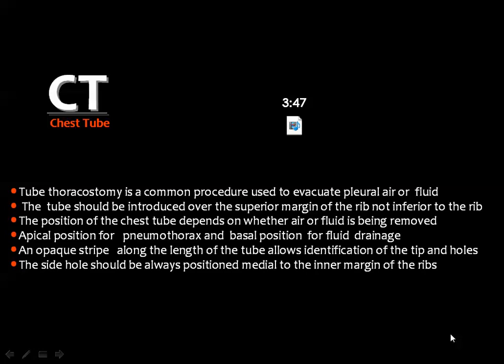Then we came to the chest tube or the thoracostomy tube, which is a common procedure in the ICU patients used to evacuate pleural air or pleural fluid.